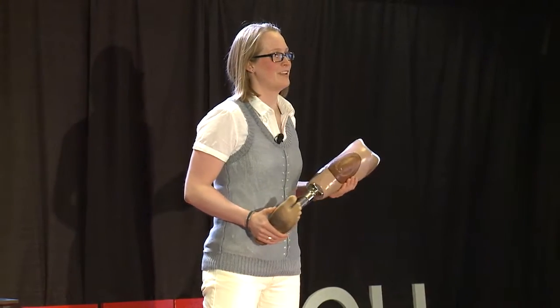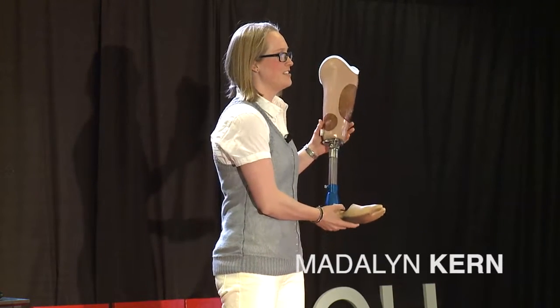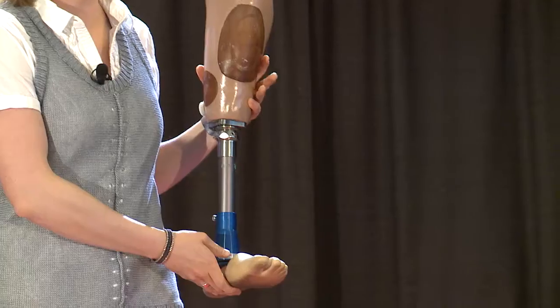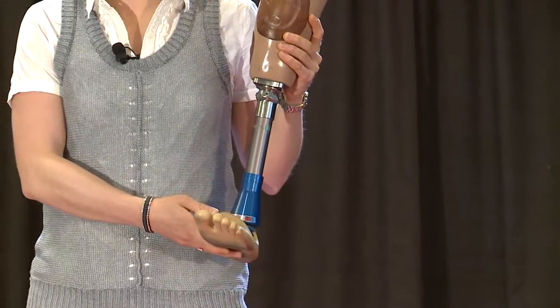Good evening. Right now, I'm going to give you a brief tutorial on lower limb prosthetic devices. This is a lower limb prosthetic device, and it's the most common type of device given to someone who's had an amputation below their knee.